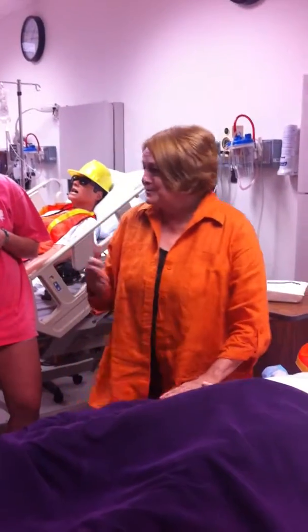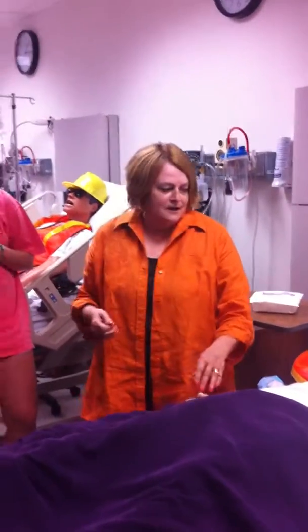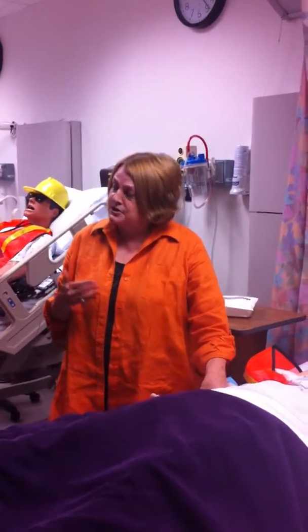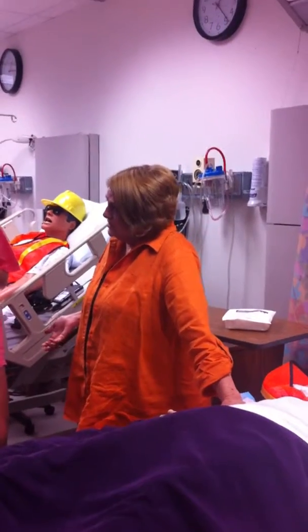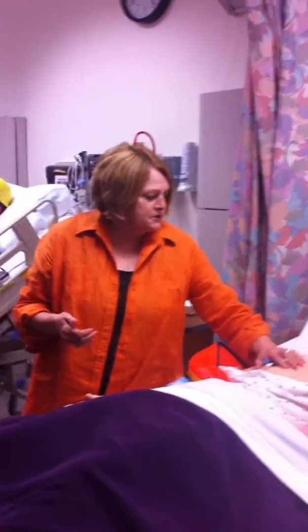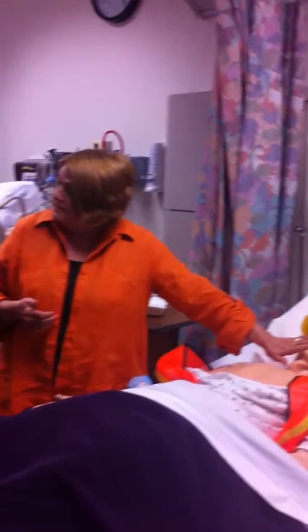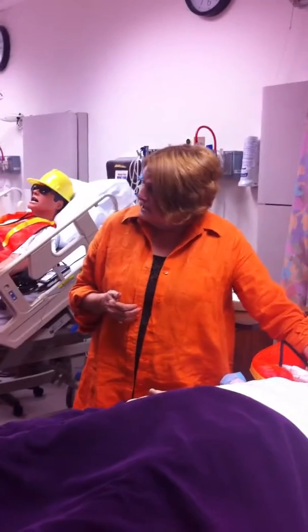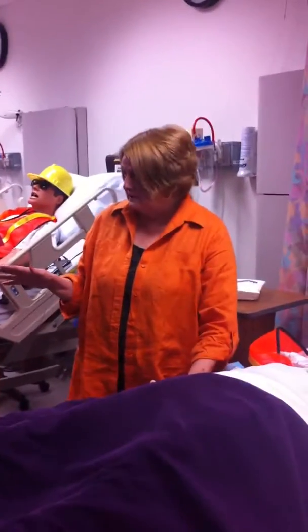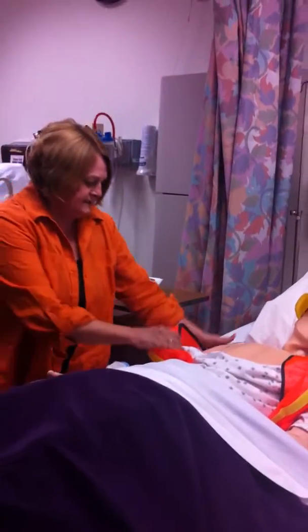I've done all these critical things like assess the patient for pain. I've given the patient an opportunity to go to the bathroom to empty their bladder because once we get started they can't continue. I have given the patient information about turning his head and not coughing, talking, or breathing over the site. Checked my armband, all those safety things I did. Okay, so now I'm just down to the down and dirty of changing a dressing.